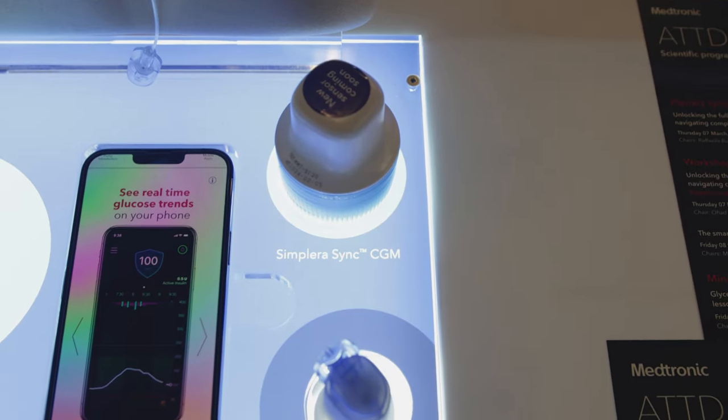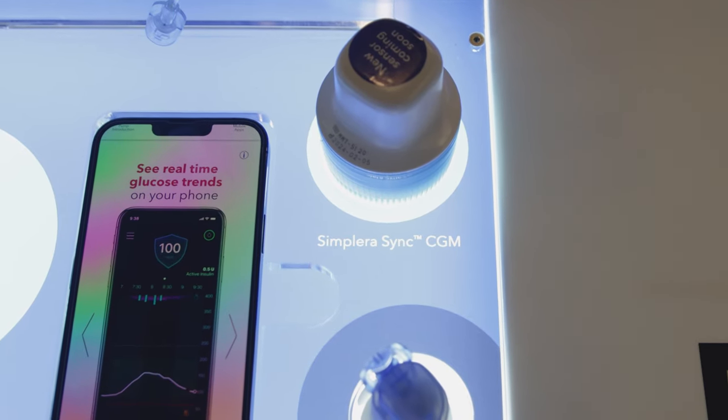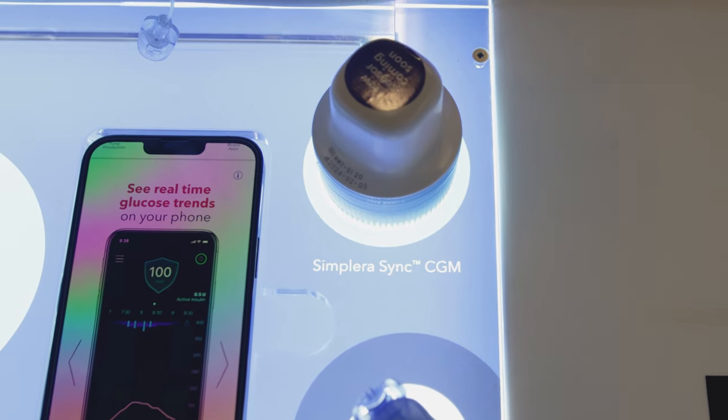The Simplera app is really used for sensor management — pairing a new sensor, ending a sensor session — and that's also where low glucose management happens: predicted low alerts, low alerts, and urgent low alerts. It's thought of as the sensor management tool, while the rest of the functionality lives within the InPen app.